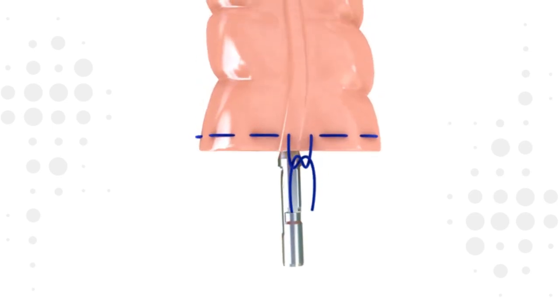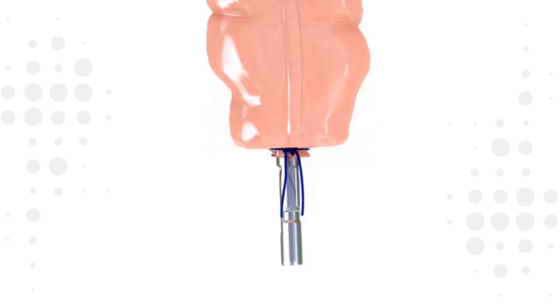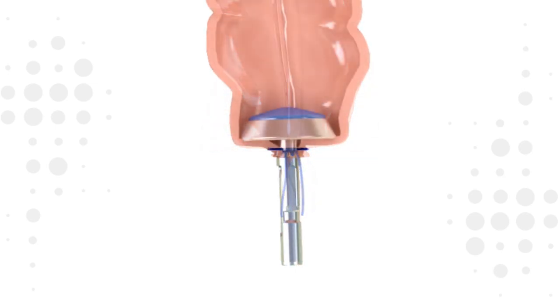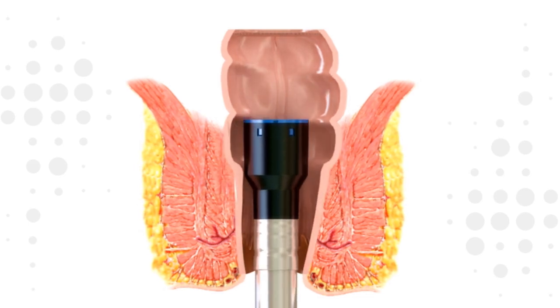The anvil is inserted into the lumen and secured using a purse string suture technique. Ensure the purse string suture is tied above the tying notch. Alternative methods for anvil placement may be used based on surgeon preference. Insert the device up to the closed lumen with the trocar fully retracted.